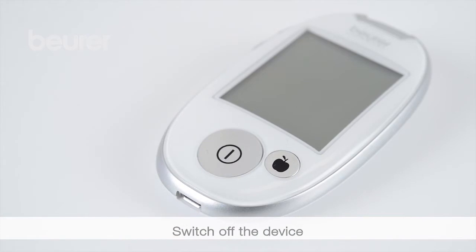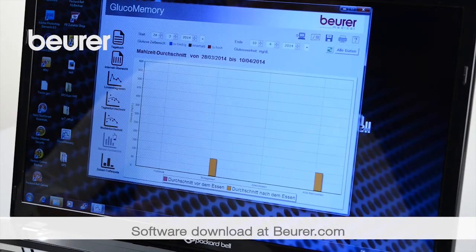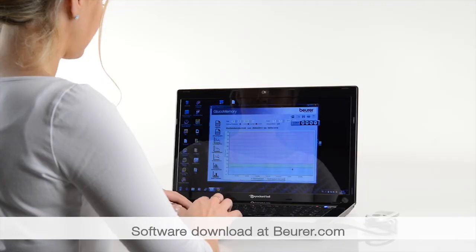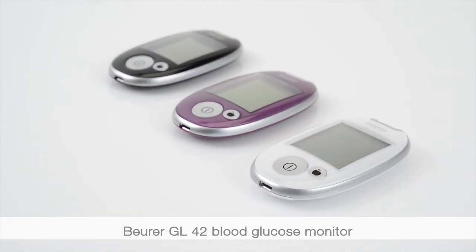Switch off the device. You can request individual values or average values. It is possible to perform software-based analysis using the Boire gluco memory or the health manager. Stay healthy.